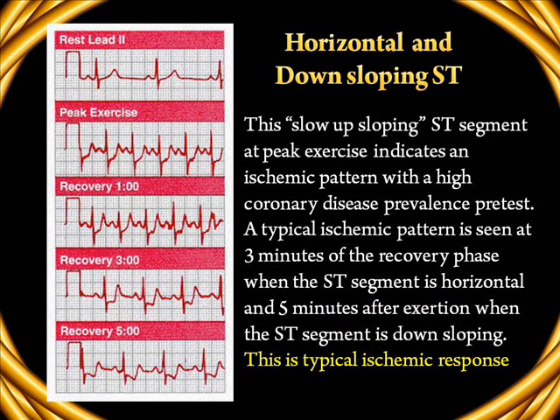Let us look at this ECG. Resting lead, lead 2 in rest, peak exercise, 1 minute, 3 minutes and 5 minutes is compared. In all the tracings here, of course the resting ECG is not showing any ST segment changes, but once the exercise has started, from peak exercise to recovery stage, we see the ST segment depressions with downsloping of the ST segments during the recovery phase. That downsloping is characteristic and typical of ischemic response.